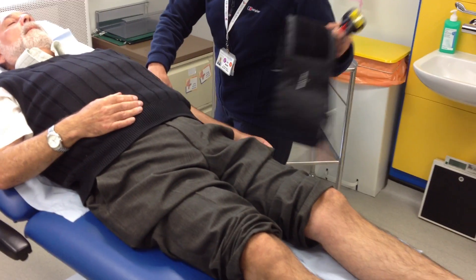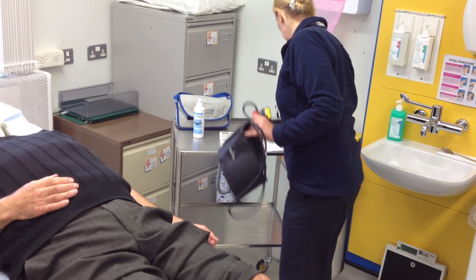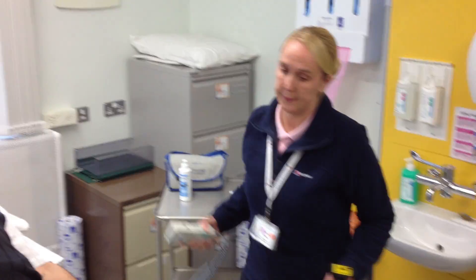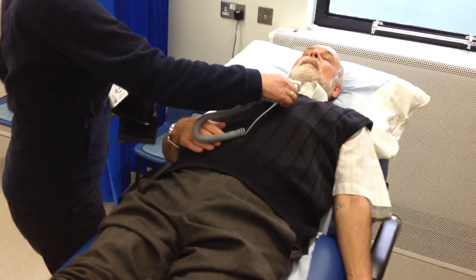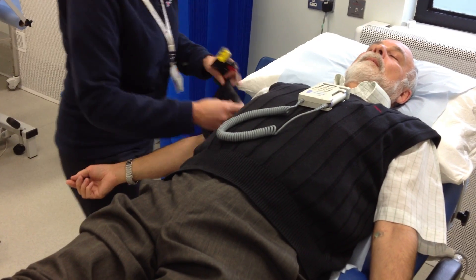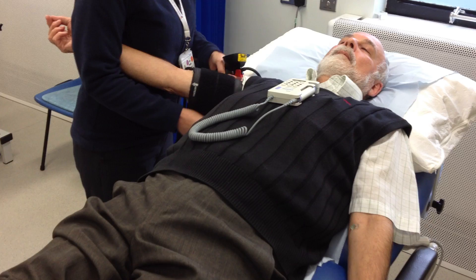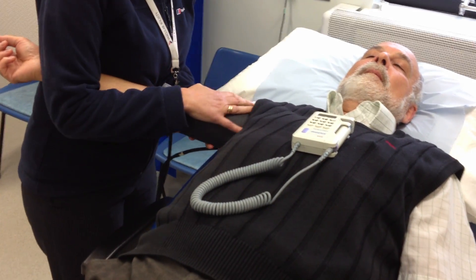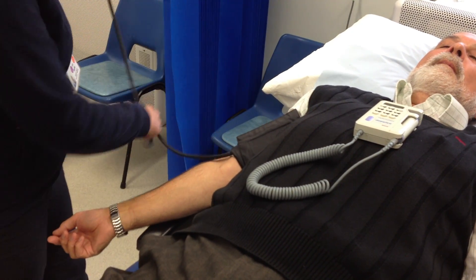The result is recorded on the proforma. Now the second brachial reading is taken. For the sake of the ABPI, we will be using the highest of the two brachial readings as the reference point. Again, the cuff is placed parallel wrapped around the upper arm, about 2cm above the elbow crease.